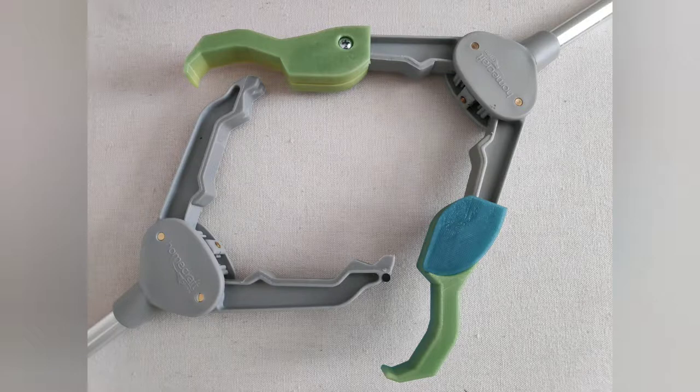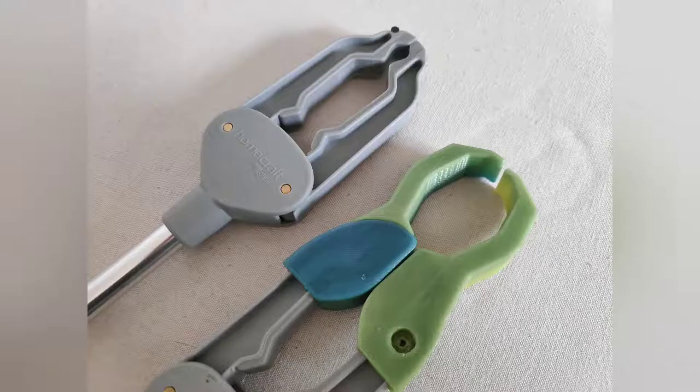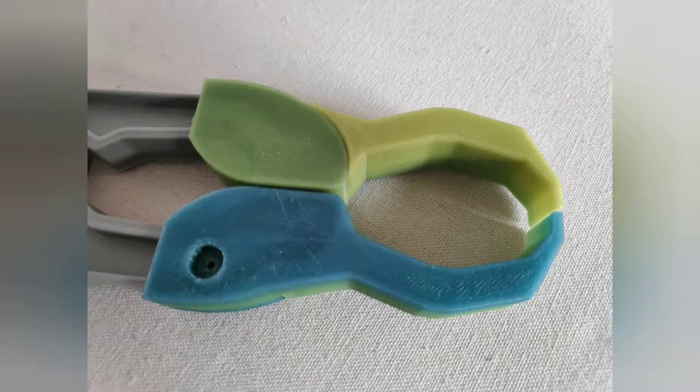Enabled.me provides bespoke accessibility aid design and 3D printing services. Let's show you the benefits of this extension and how this works.